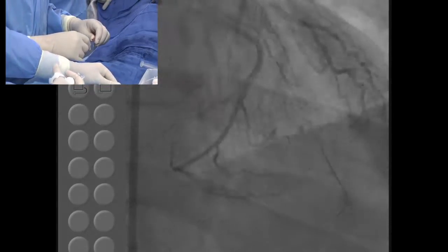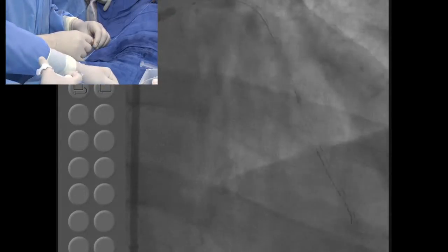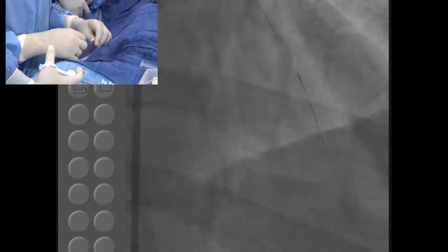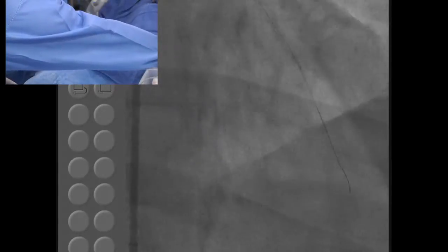Will dye now. See, that's where we are subintimal. Same place, higher up. Okay, little dye again. Go more. Get the Progress 200. Oh yeah, I have it. I think somewhere here we need to change. Okay, we'll dye again.